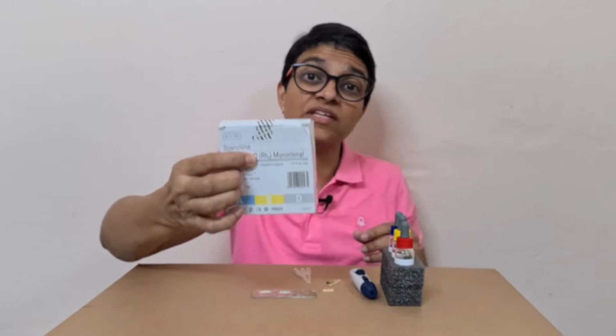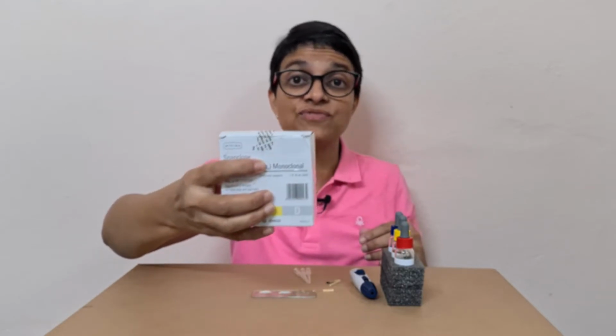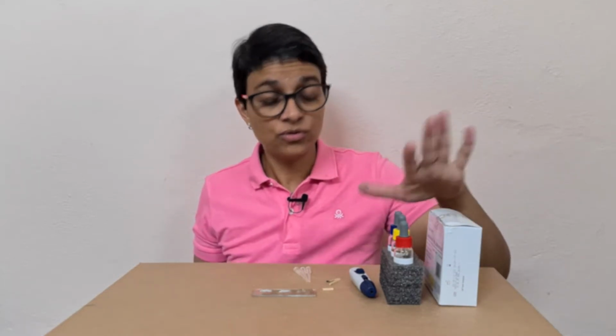Based on the presence of the D antigen or the RH factor, we determine them as positive or negative. These two are the most significant blood groups which we use for blood transfusions, testing the compatibility between two individuals. So therefore, we'll be doing this experiment today.